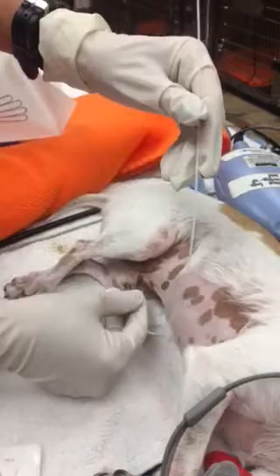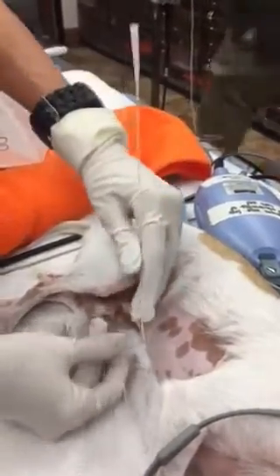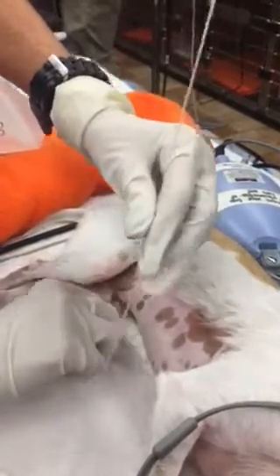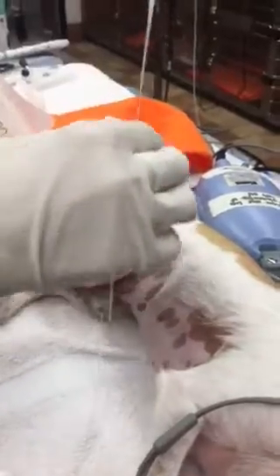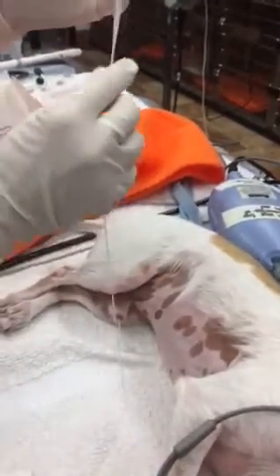I need a syringe — I might have sterile gloves. And once I feel that it's all the way into the bladder, I am going to use a syringe — thank you.